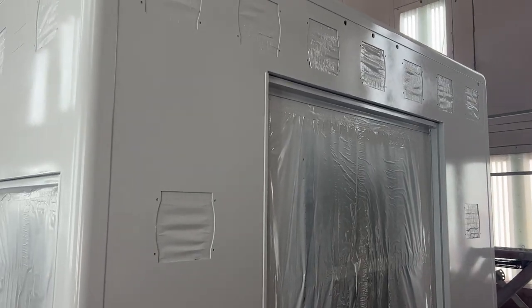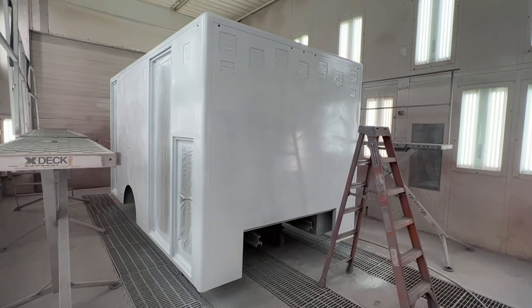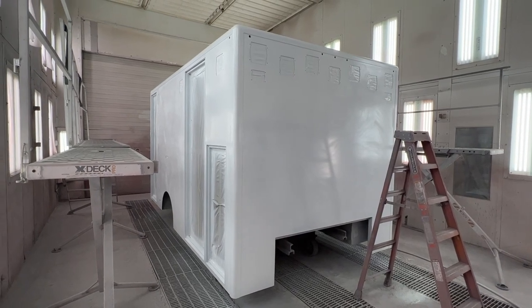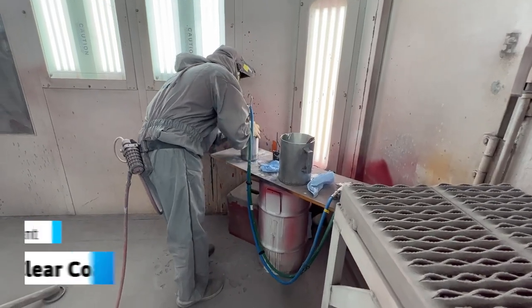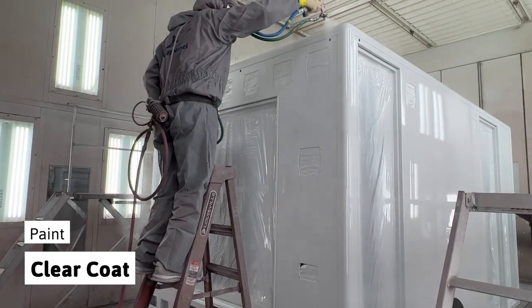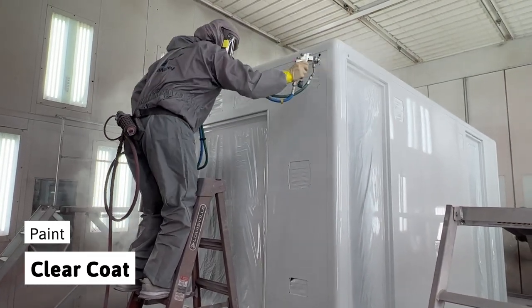As you can see, the color looks rather dull at this stage. After a quick baking cycle, a clear coat is added to further protect the paint, add scratch resistance, and achieve a nice mirror-like shine.